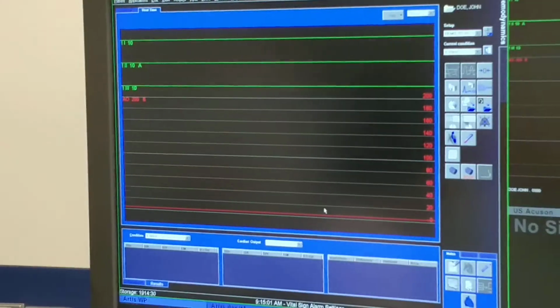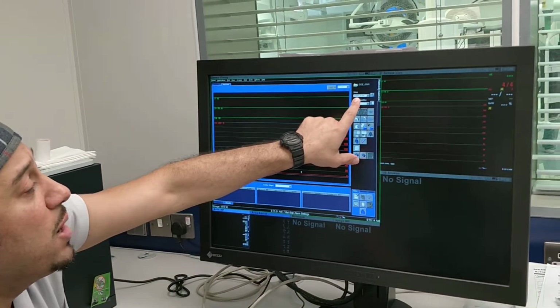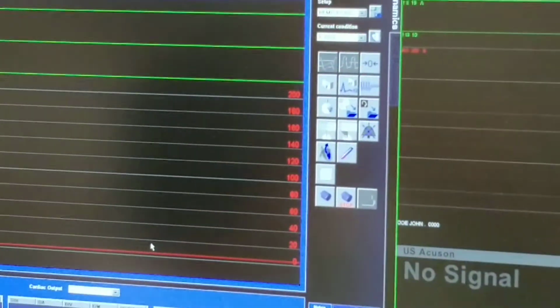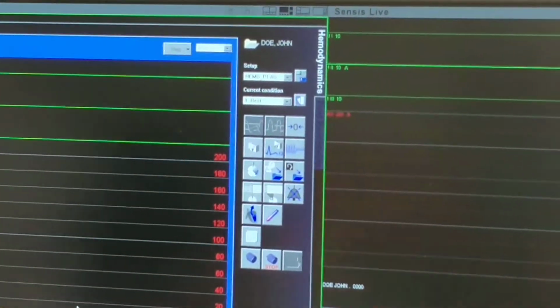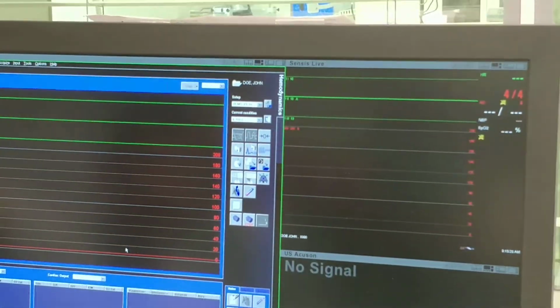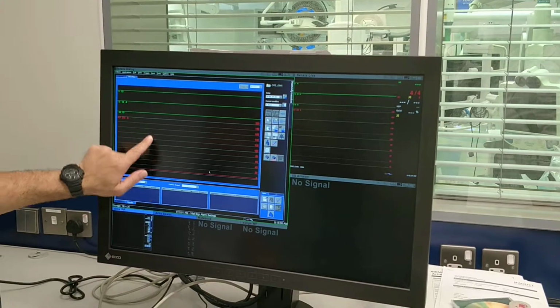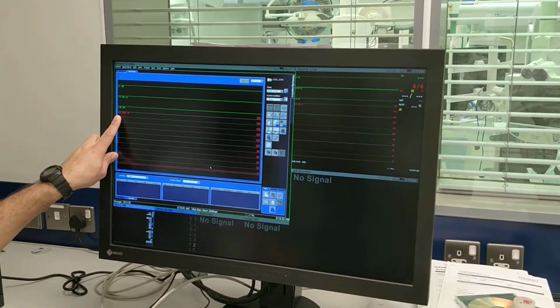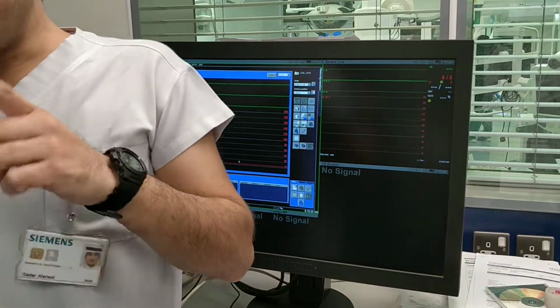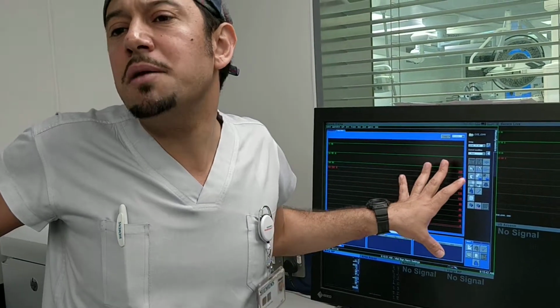The moment you register the patient, by default, have a look at here. It says hemo, P1 AO. What does that mean? That means the default selection, the machine will give you three leads as ECG plus 1 pressure. The machine presumes it's what? It's aortic. This is the default. And guess what? 95% of coronary diagnostic procedures will need that maximum, okay?